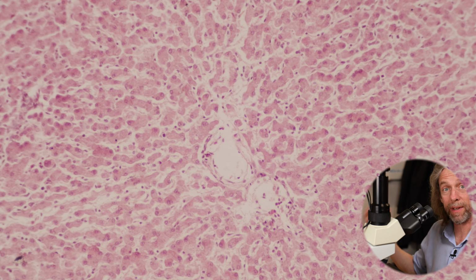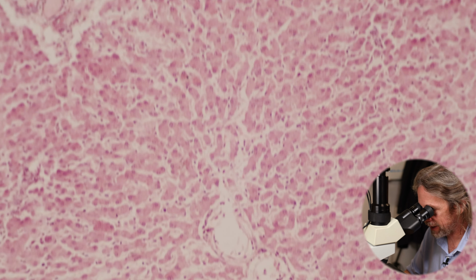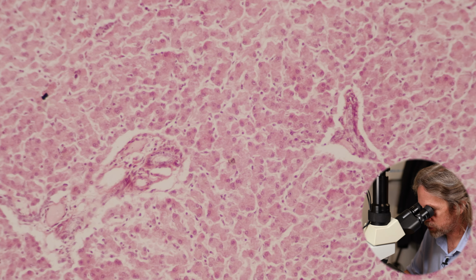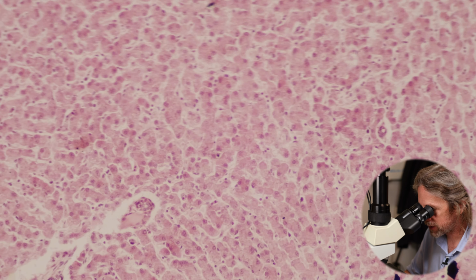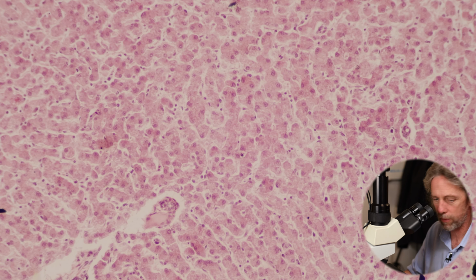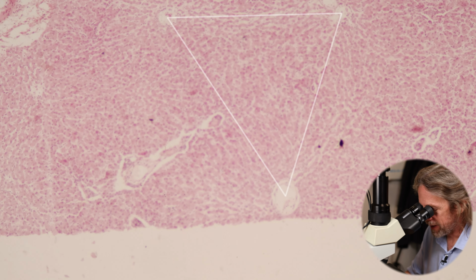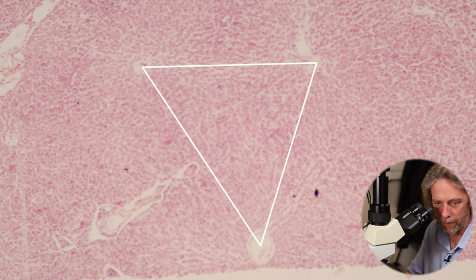But you can see how tricky it was to figure all this stuff out, right? And it's described very nicely. Sometimes it does look cleaner than this. So that's your hepatic lobule. Now your portal lobule is another triangle where you have three, well, where you've got three central veins. You can make all sorts of shapes with your human brain, can't you?